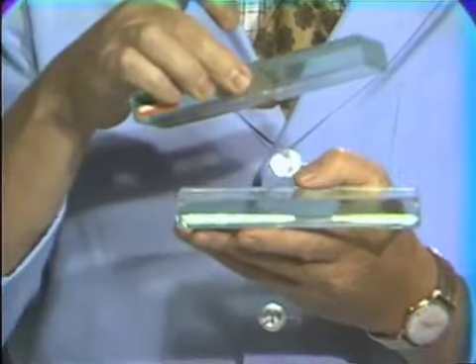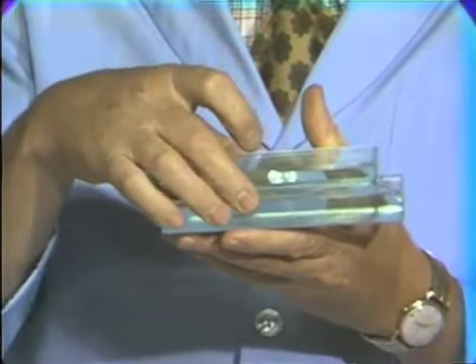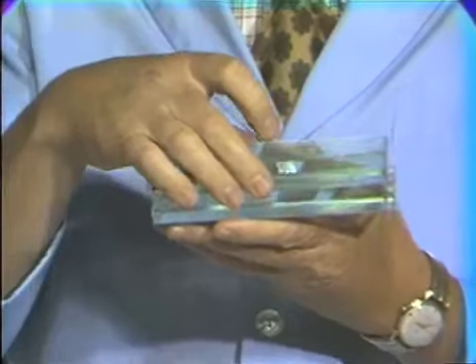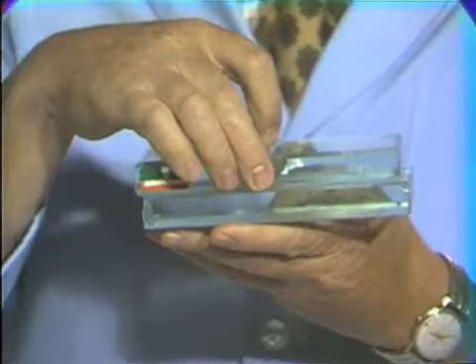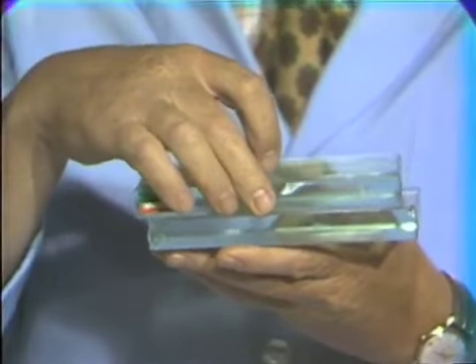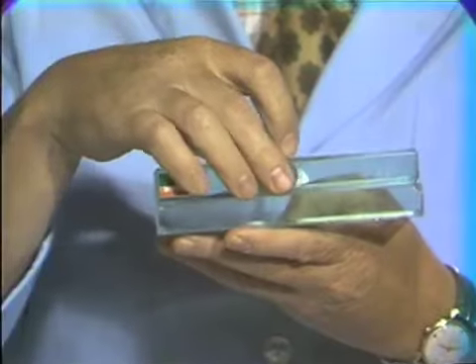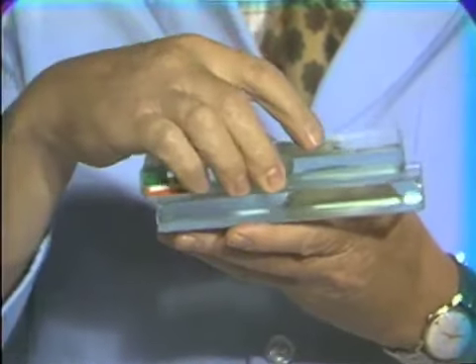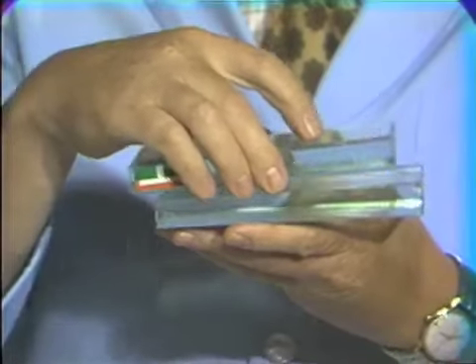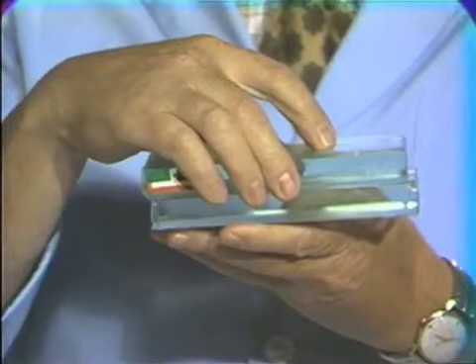If this represents the ridge and this represents the appliance, our objective is to get these to fit as closely together as we can. Glass slabs or glass plates placed together give us a simulation of this. However, we can see here we lack retention, or these 2 slabs won't hold together because they're both dry.